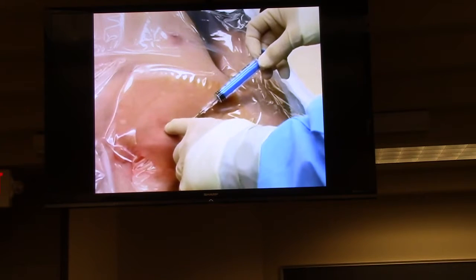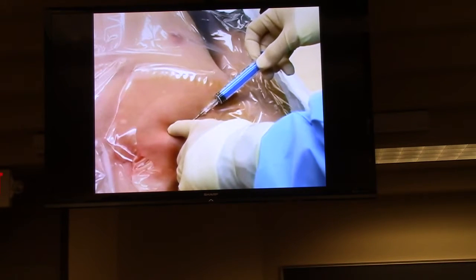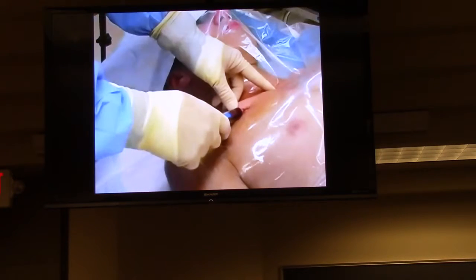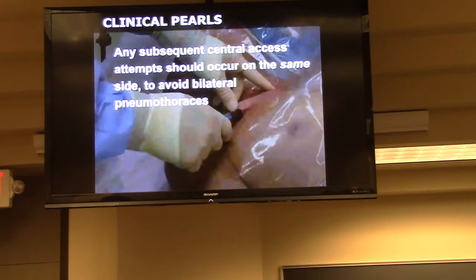It may be helpful to push down on the needle with your non-dominant hand to guide it toward the posterior surface of the clavicle. Pull back on the plunger as you advance. Entry into the vessel will be heralded by return of free-flowing, dark venous blood into the syringe. If air is aspirated, the pleura has been violated, and the patient should be evaluated for pneumothorax. Any subsequent central access attempts should occur on the same side to avoid bilateral pneumothoraces.